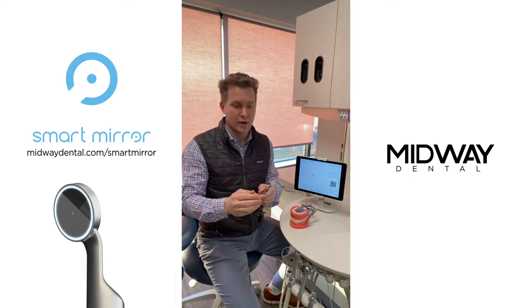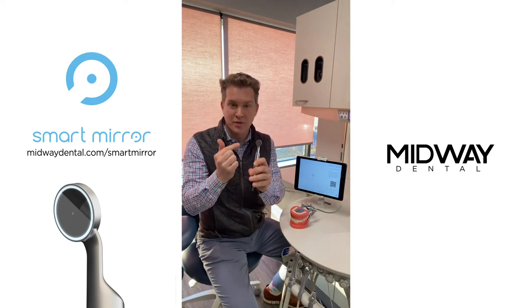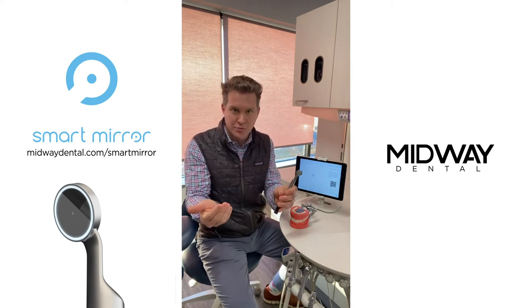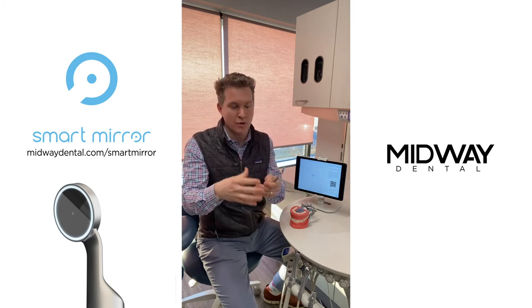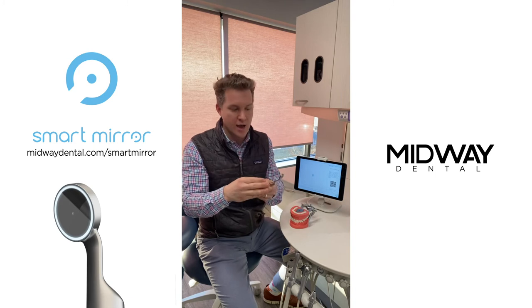The mirror itself is very advanced. We have a sapphire lens which is highly scratch resistant. The electronics of the mirror heat up the mirror so it doesn't fog in the patient's mouth.